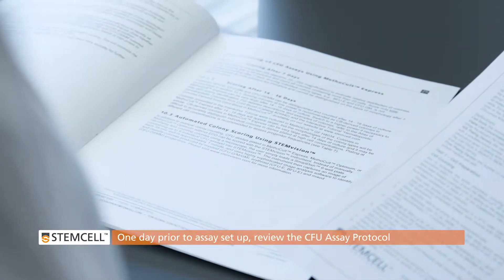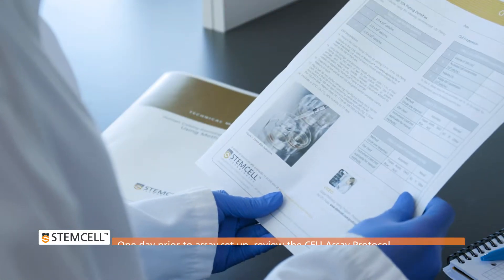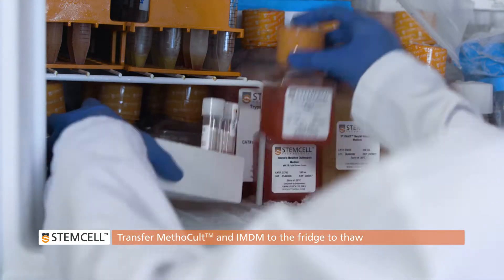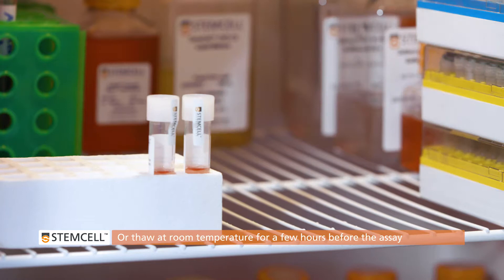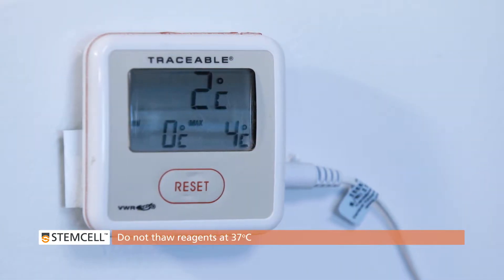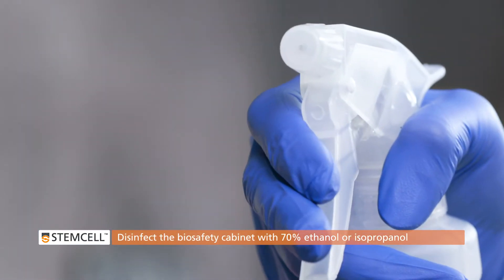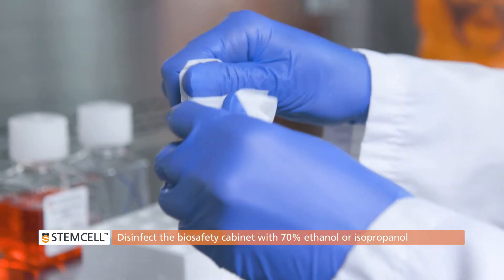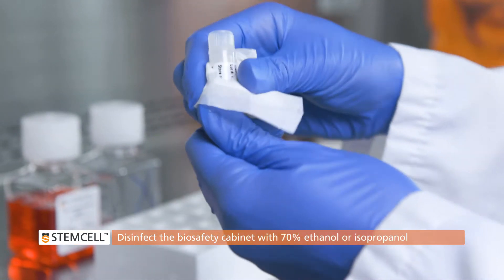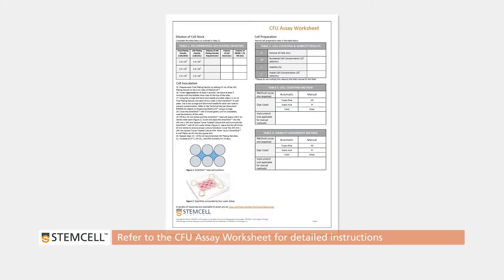One day prior to assay setup, review the protocol to ensure you fully understand it. Transfer the Methicult and IMDM from the freezer to the fridge to thaw overnight, or thaw reagents at room temperature for a few hours on the day of the assay. Do not thaw reagents at 37 degrees Celsius. On the day of the procedure, prepare the biosafety cabinet by disinfecting it with 70% ethanol or isopropanol and place all reagents and equipment into the cabinet. Refer to the CFU assay setup worksheet for detailed instructions on the procedure.